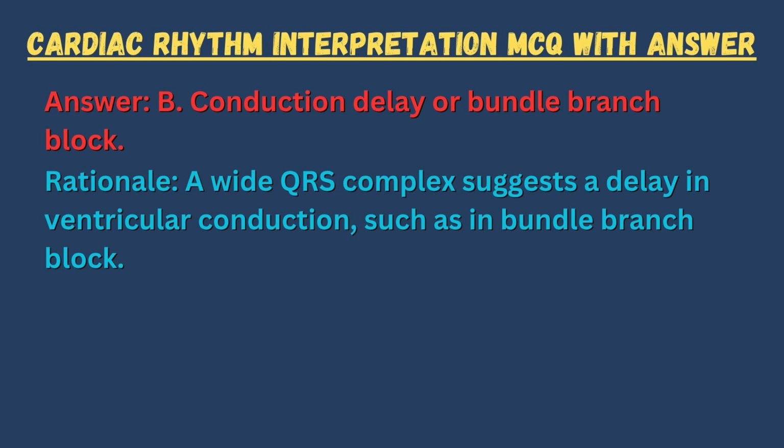Answer. B. Conduction delay or bundle branch block. Rationale. A wide QRS complex suggests a delay in ventricular conduction, such as in bundle branch block.